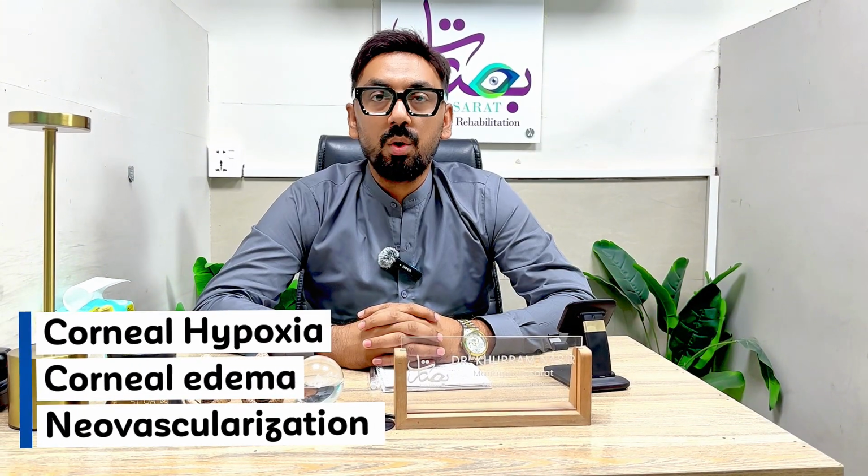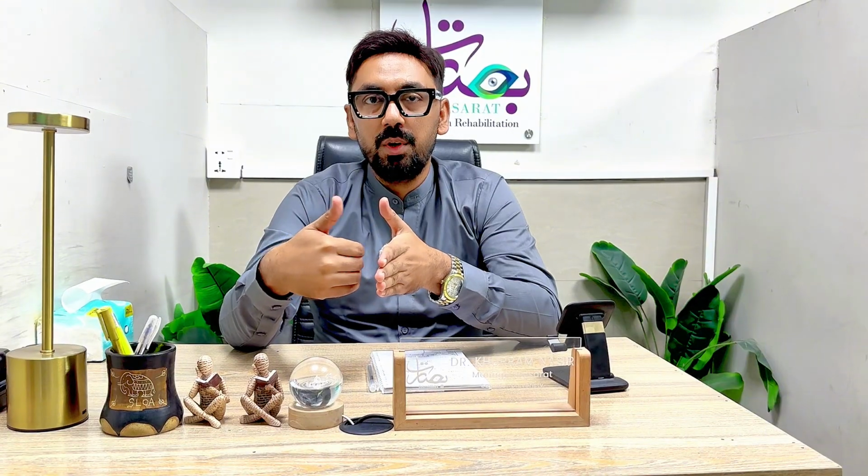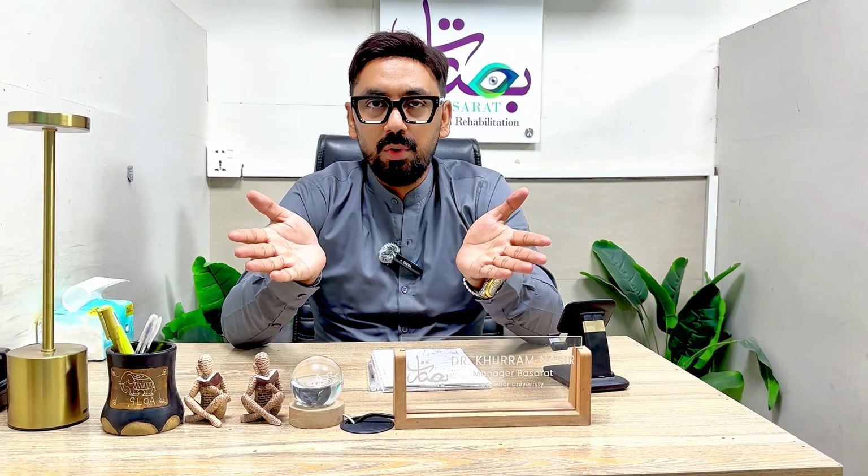If we use hard lenses, or lenses which do not have a good Dk over t value, it can cause corneal hypoxia, corneal edema, and neovascularization. These types of corneal disorders can come when we use a lens which has a low Dk over t value, or no Dk over t value at all.